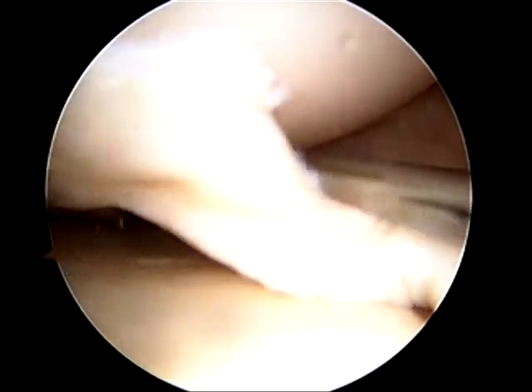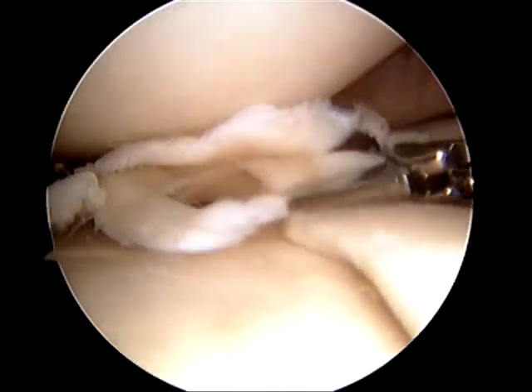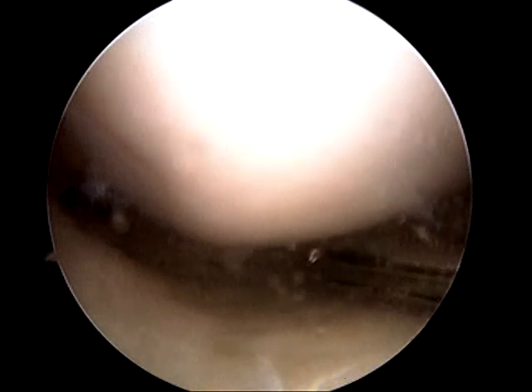The meniscus is a cushion that sits inside the knee between the two bones. Here we can clearly see that the meniscus is torn and it looks like a piece of crab meat floating in the knee. The scissors are then introduced through the portals to allow for easy removal of the cartilage. Once the edges have been cut completely, a grasper is inserted into the knee to allow the fragment to be removed in one large piece.